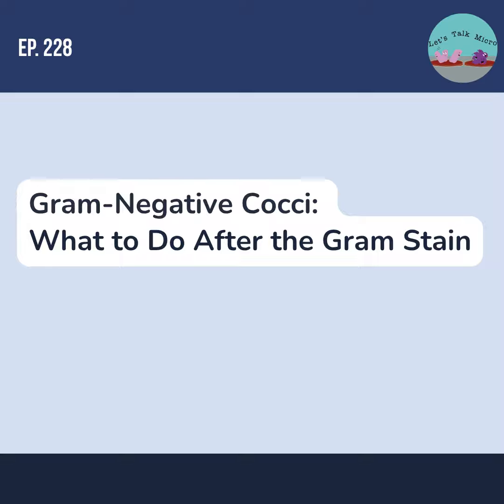Okay, so let's do a quick recap. On the previous episode, we talked about gram stains. Now we are talking about media. So we talked about the JEMBEC system, the transport system. We mentioned the fact that most of these, like Neisserias, grow on blood and chocolate. Keep in mind that Neisseria gonorrhoeae grows on blood, but very weakly. So make sure you don't miss that on the urine bench. And then we talked about Modified Thayer-Martin, Martin-Lewis, and NYC agar.